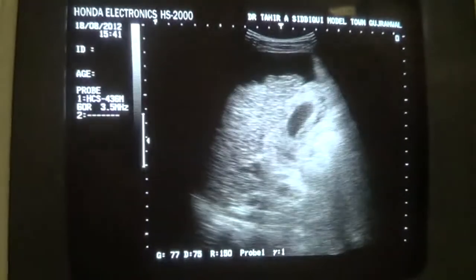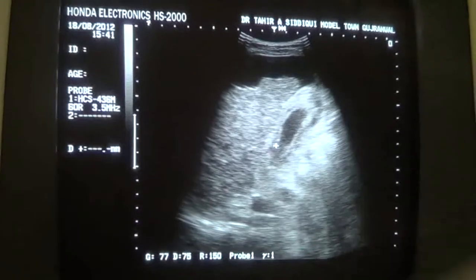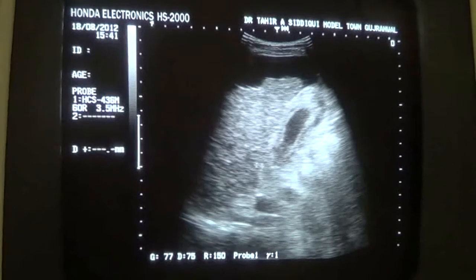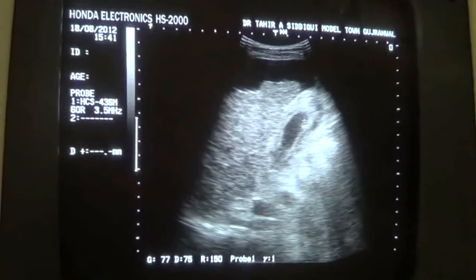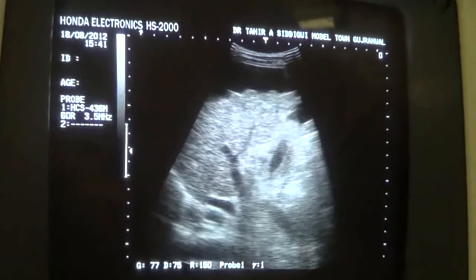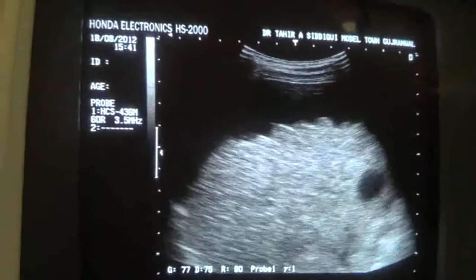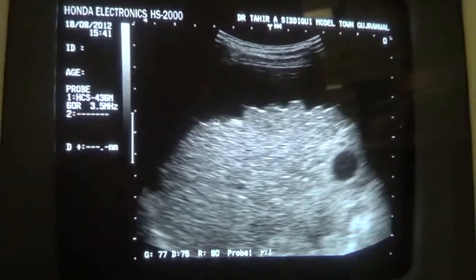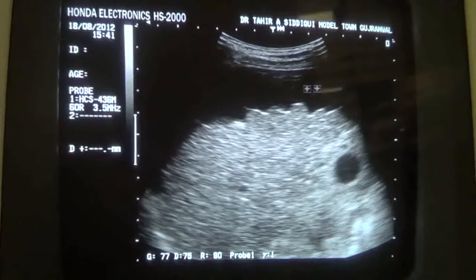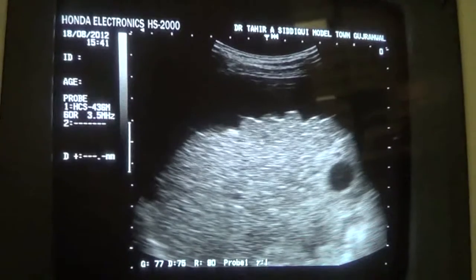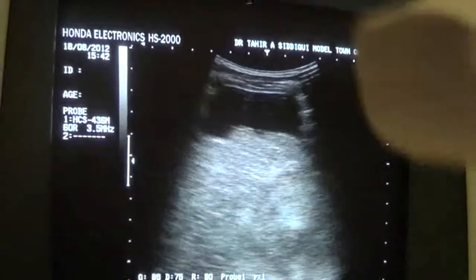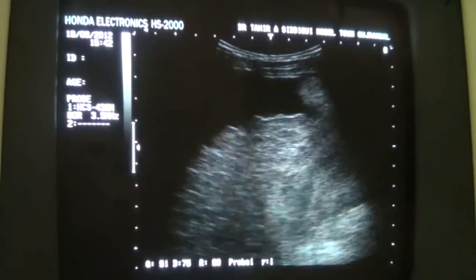This is a shrunken liver surrounded by fluid. This black area anterior to the liver is the fluid. This is the gallbladder. The wall of the gallbladder — in advanced cases you will see the outer surface is irregular. Note the nodular outer surface of the liver and see the waveform irregularity of the liver's outer surface, surrounded by clear ascitic fluid with no echoes. The echogenicity is globally diffused with coarseness. The liver shows generalized reduced surface area and is surrounded by fluid.